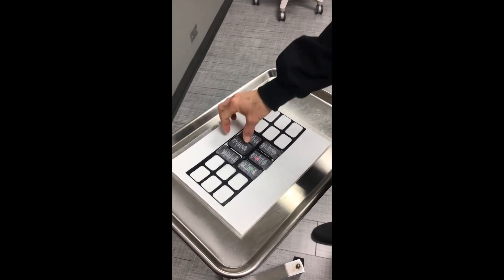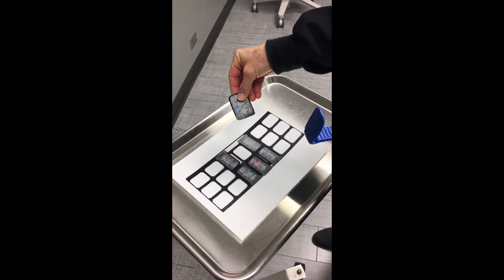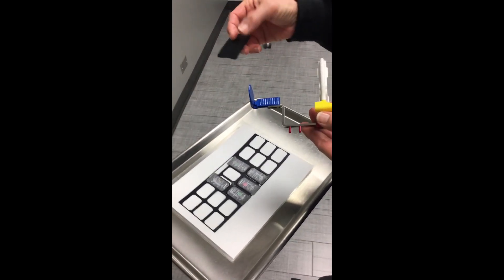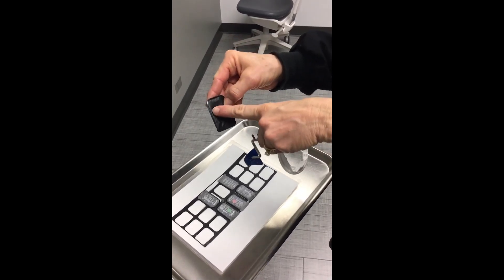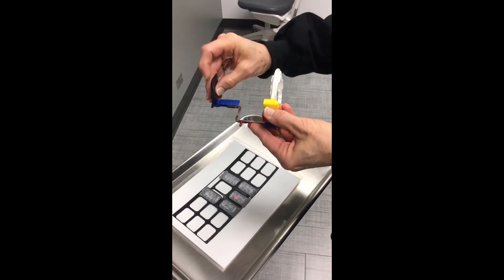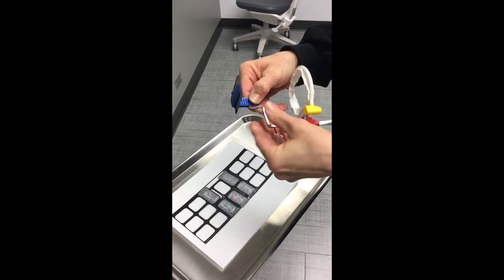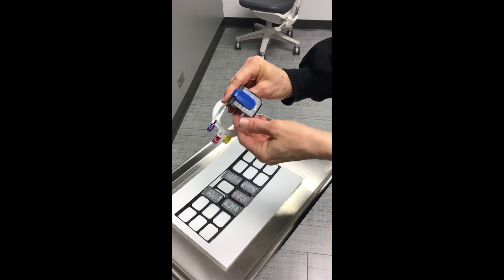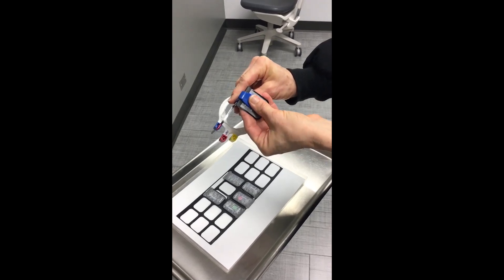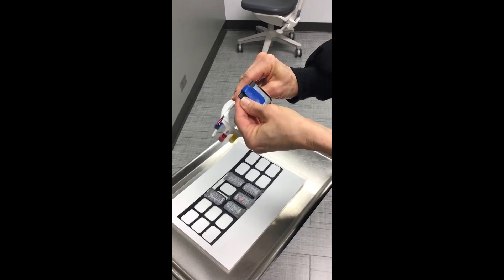We're going to start with our central projection for demonstration purposes. Place the PSP plate in the bite block with the black facing the ring. There's a slot there and you're going to slide it in. Always look at the back to make sure it's sitting evenly in the bite block — you do not want it off to the side; you want it right in the center.